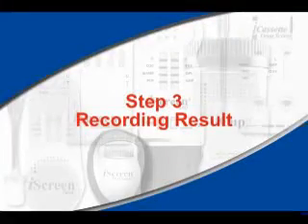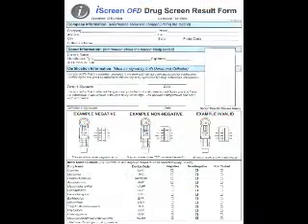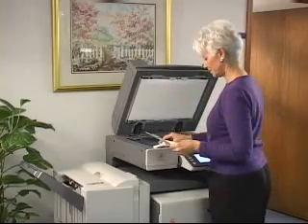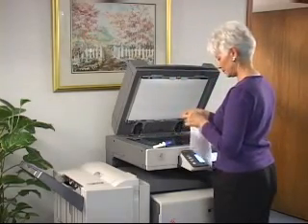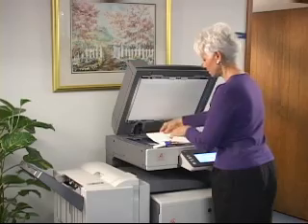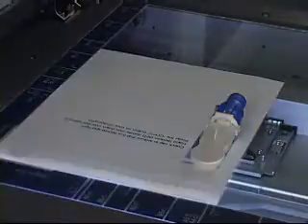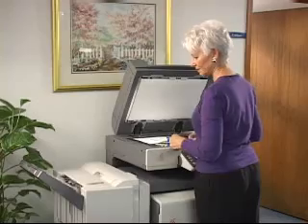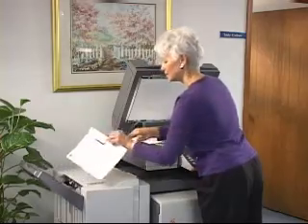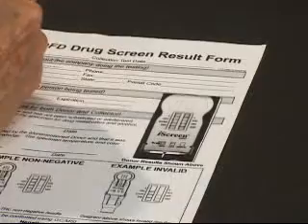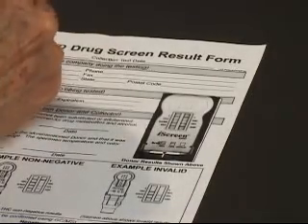Step 3: Recording Result. Each box of iScreen OFD devices comes with a photocopy template. To use the template for recording results, place the copy template face down on the scanner bed of the copy machine and place the pre-run iScreen OFD over the opening on the copy template. Then press Copy. Once a copy of the results has been made, simply fill out the photocopy by following the pre-printed instructions. Non-negative results should be handled in accordance with your company's drug-free workplace policy.